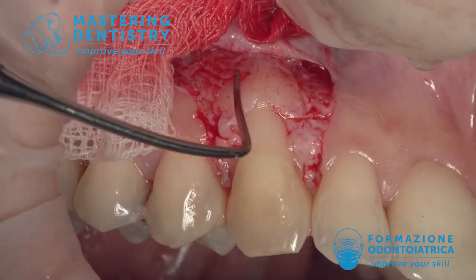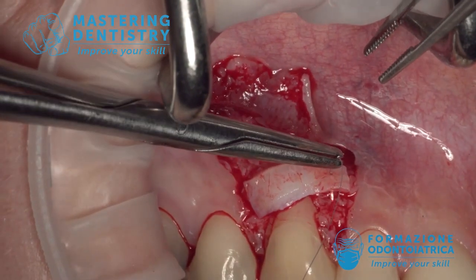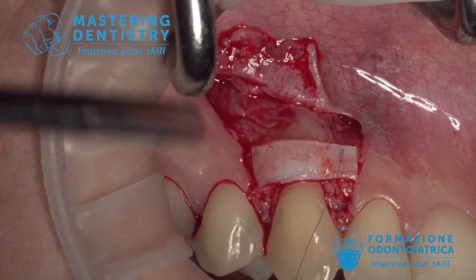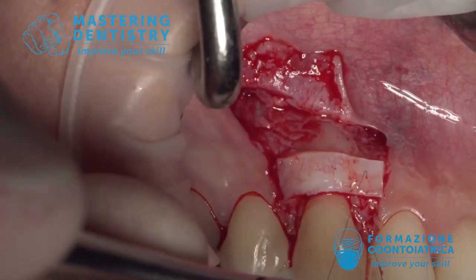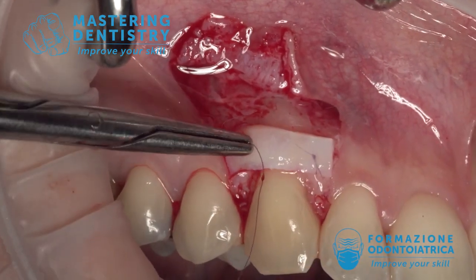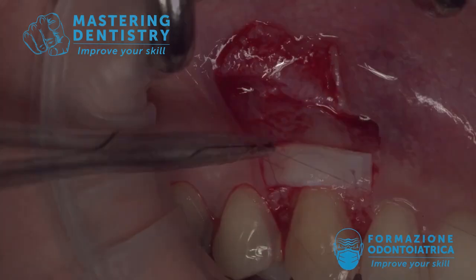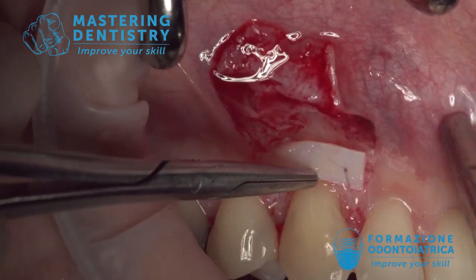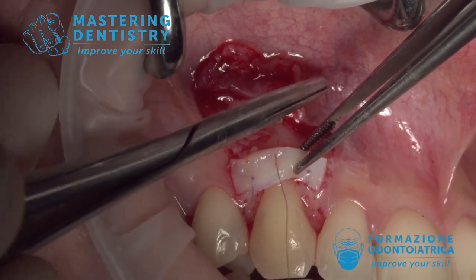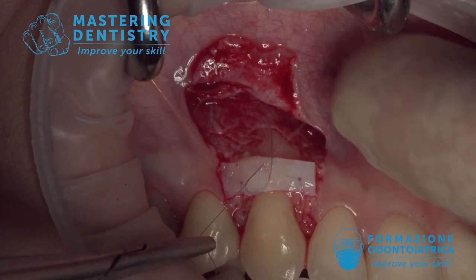Now is the time for the connective tissue graft. I have harvested it from the palate, de-epithelialized it, and now I fix it to the recipient bed with 7-0 suture and an 8mm needle — two sutures anchored to the anatomical papilla. Another suture is fundamental: it is mandatory to curve the connective tissue graft because the cementoenamel junction of the canine is very curved, so you need to bend the graft to follow the shape of the CEJ.